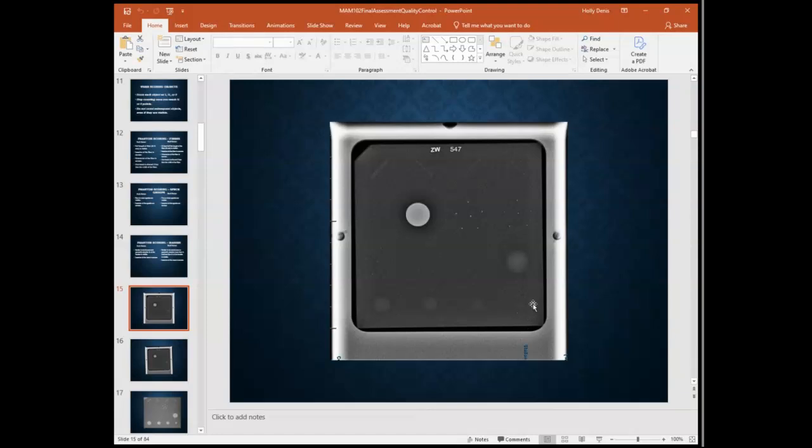Going down to this last one. When I look at it on my PowerPoint, and then I go back over here and look at it on the screen where I'm sharing it with you, I'm seeing two different things. Over here, I can see a mass on my actual PowerPoint on my monitor. But when I look at the Blackboard part that is your image, I'm not seeing it. But I see about, I think, a half. It's sort of like a moon shape on my monitor here. So I would probably give that a half a point. So 1, 2, 3, 4.5 is what I would score that one.